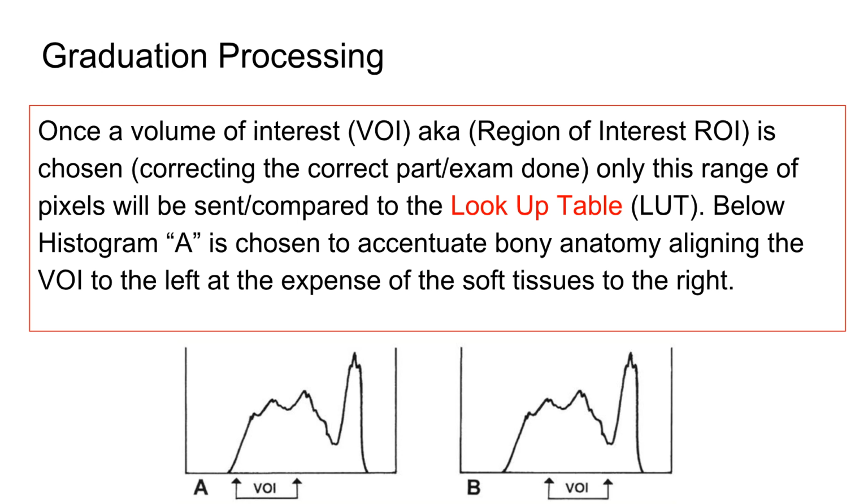Yes? After you change the scaling, does that count as a post-process? Or is that still pre-process? See, that's the first couple of slides. A lot of people think of it as post-processing, but it's really doing the same pre-processing again. Just maybe constraining it a little, or asking it to lean towards a longer scale or lean towards a shorter scale. Essentially, you didn't like how it did the first time.